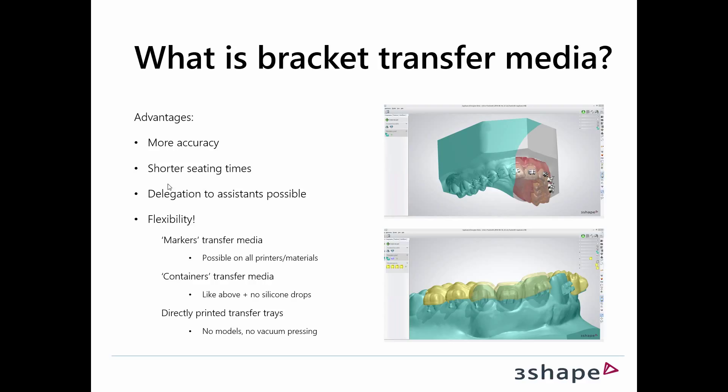We have another method where you can disable the need for silicon drops, and we have a way where you can circumvent the entire printing of models and vacuum pressing of these models.